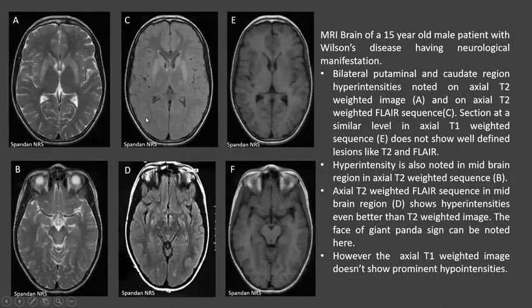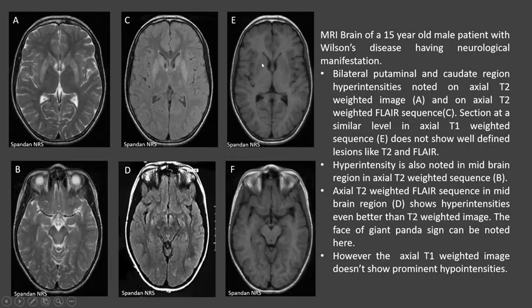The following are MRI brain sections from a 15-year-old male patient with Wilson's disease. Image A shows bilateral putamen and caudate region hyperintensities on axial T2-weighted image. The FLAIR T2-weighted image also shows bilateral putamen and caudate region hyperintensities. However, in the T1-weighted images, the lesions are not as prominent as seen in T2 and FLAIR sequences. Hyperintensity is also noted in the midbrain region on axial T2-weighted sequence.